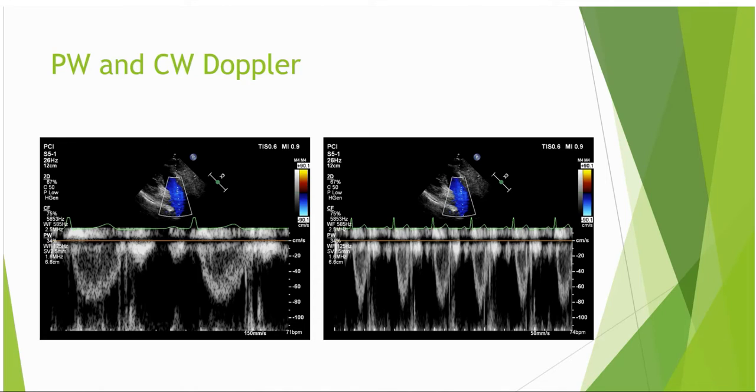If the sweep speed is set too fast, you may only capture 2 profiles. One has a high velocity and the other one is low. Which one is correct? This is significantly more difficult for a viewing physician to determine. An alternative is to keep the same sweep speed and take 2 shots of the trace over time, but no one really wants to double the amount of Doppler clips. Also note the individual Doppler signals are actually vertical lines rather than pinpoints.